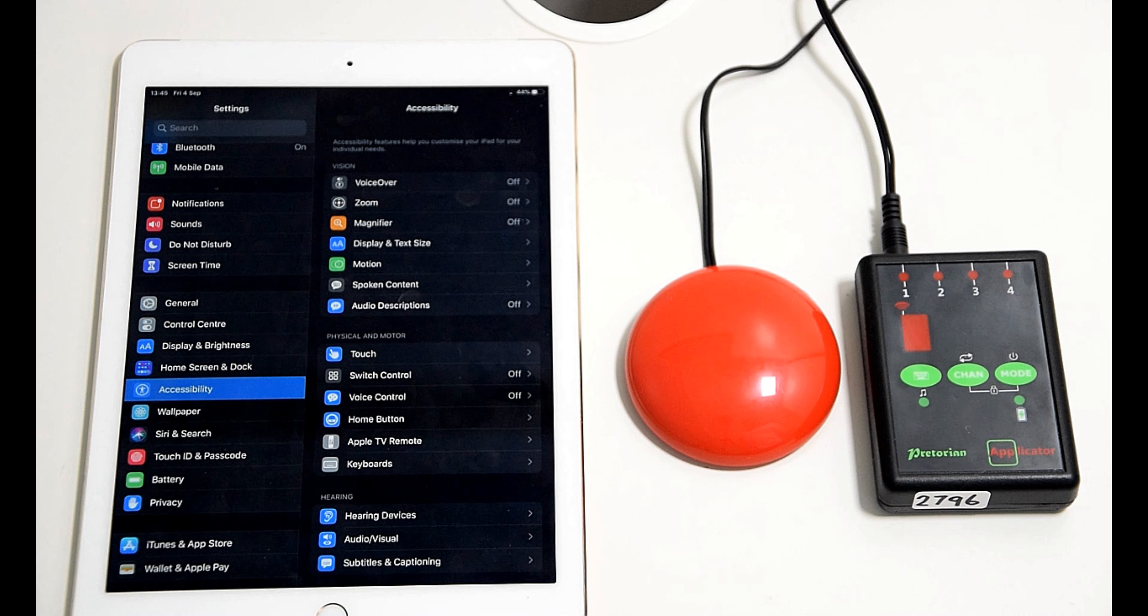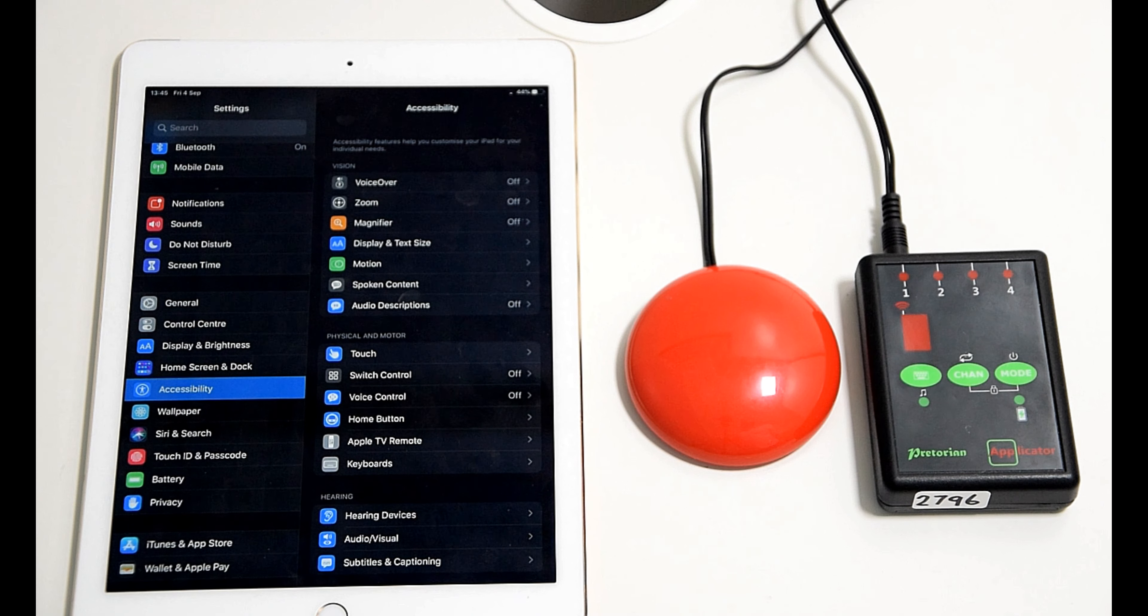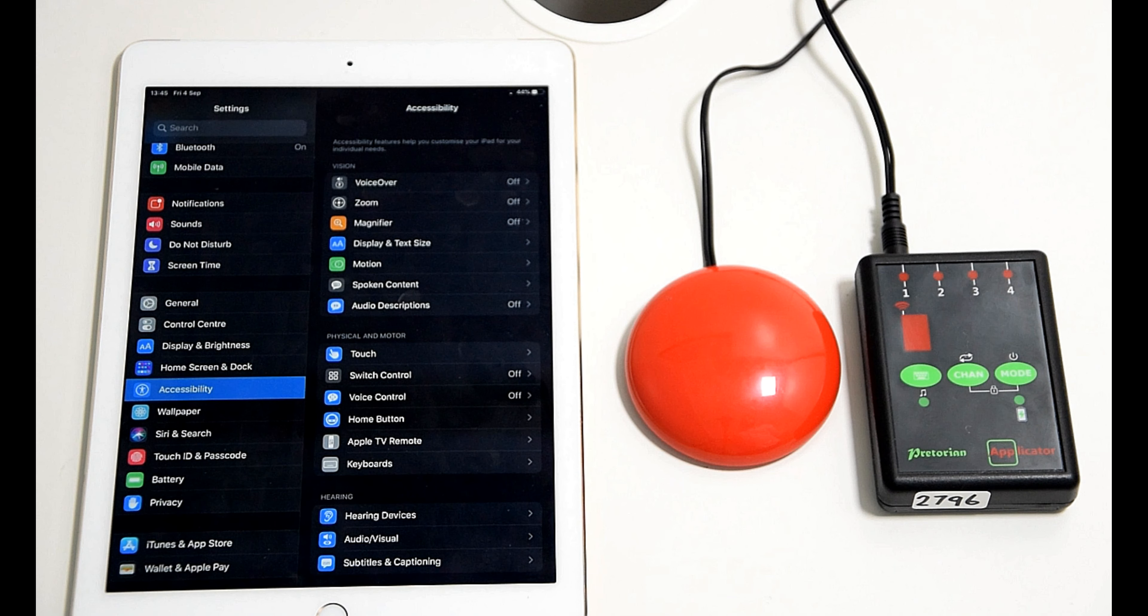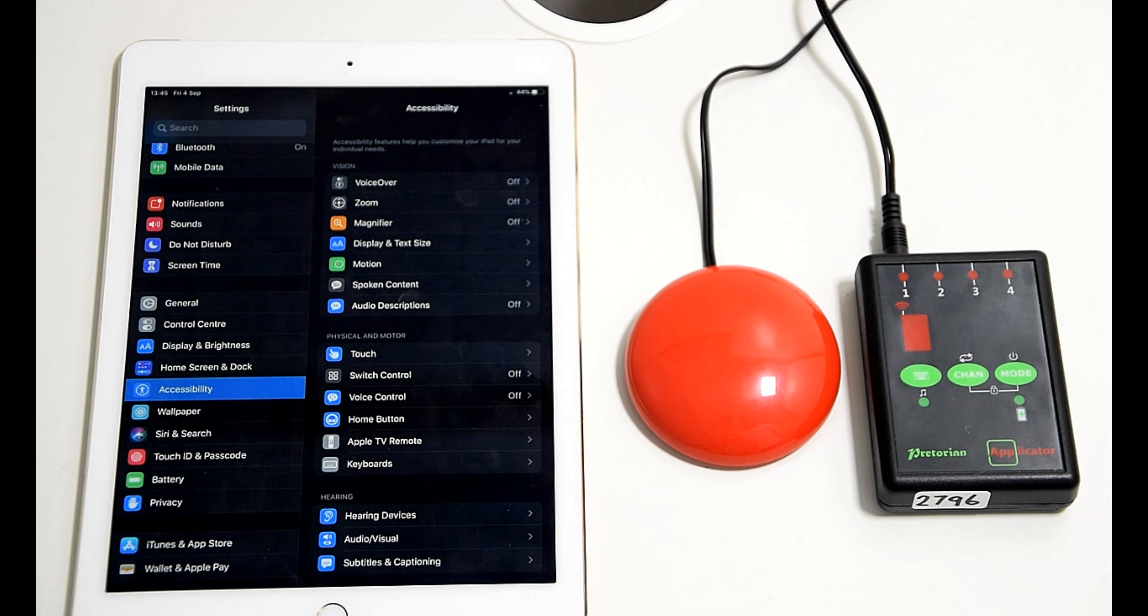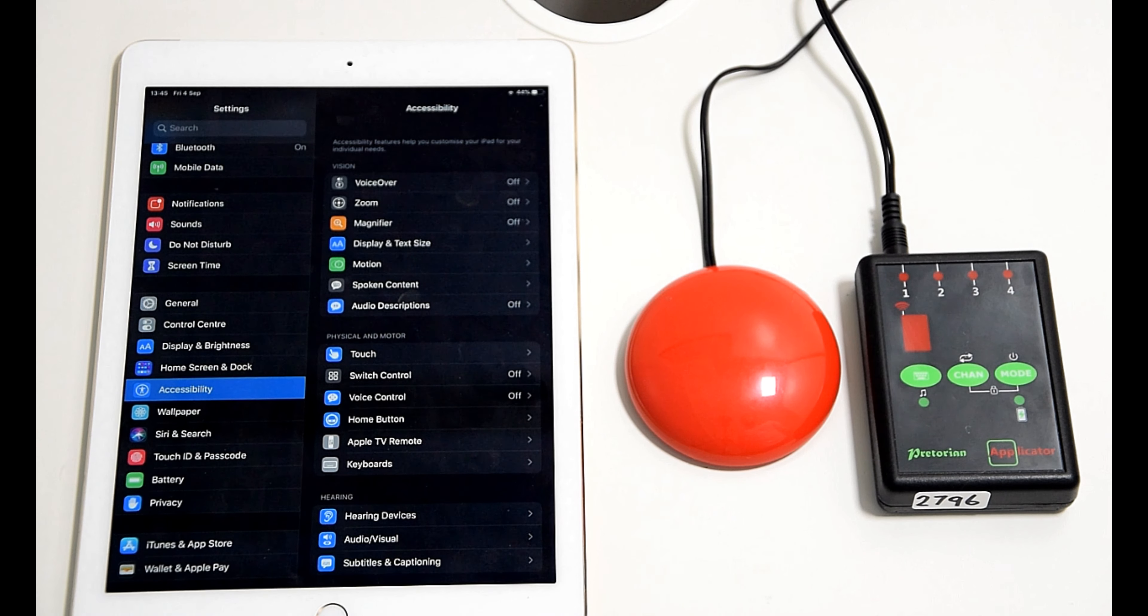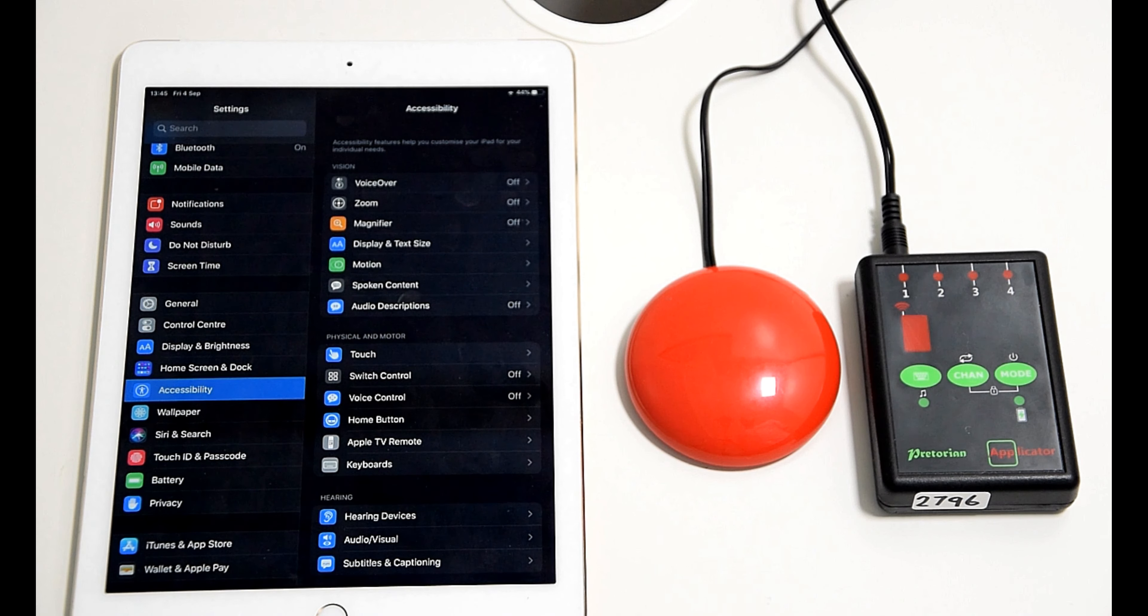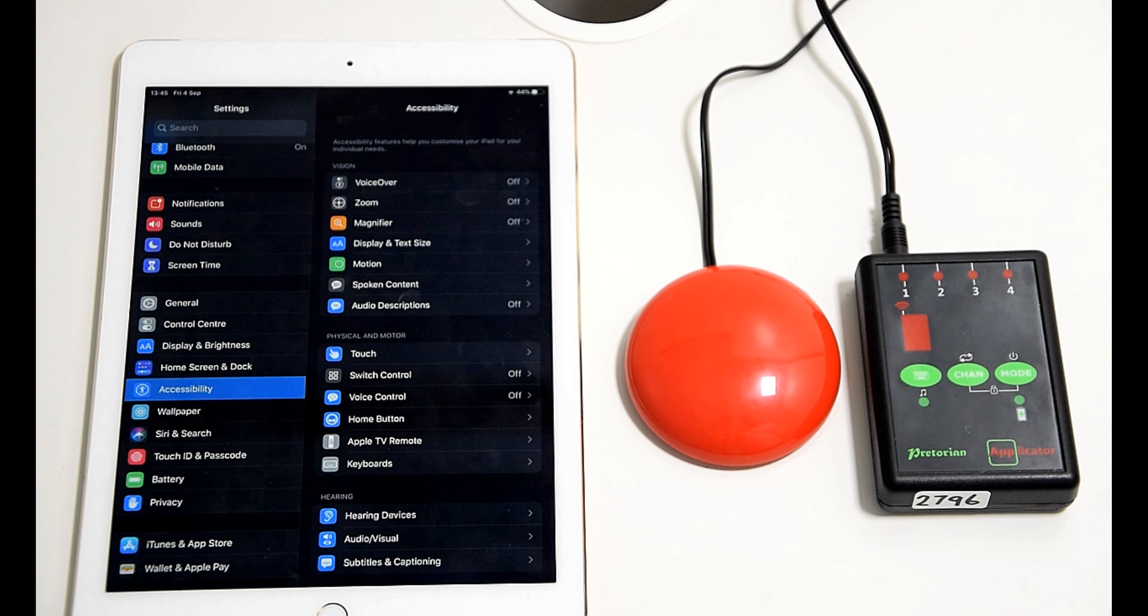So in that first video we showed you how to use two switches plugged in and manually scanning and selecting the different options and how easy it was with the applicator.